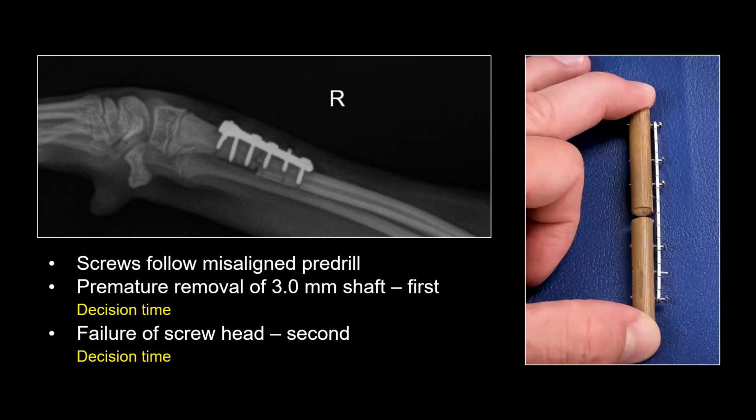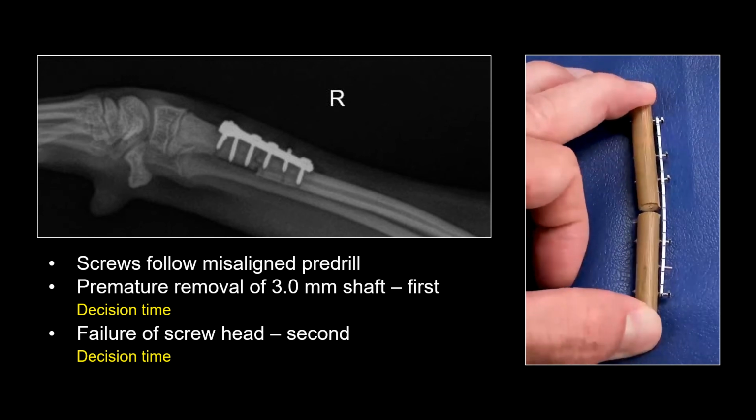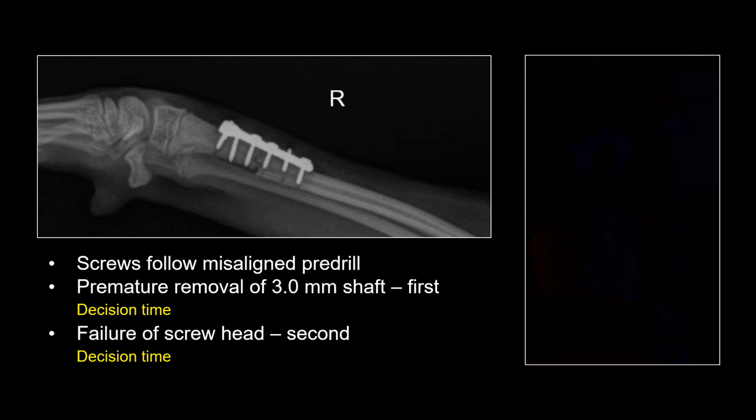And then the second decision time, if you fail a screw head, what to do. An example of this: either take some forceps and remove that screw and replace it with a monocortical, or pre-drill, re-drill, and put a longer screw in, or perhaps leave as is. I play the video to show and remind that the VetKISS system does not require the head of the screw to be against the plate, or even a screw head to exist, to lock. So it's not panic time in this scenario. It's realize things work, but at the same time, if you realize this is happening, you have an opportunity to make appropriate decisions going forward.